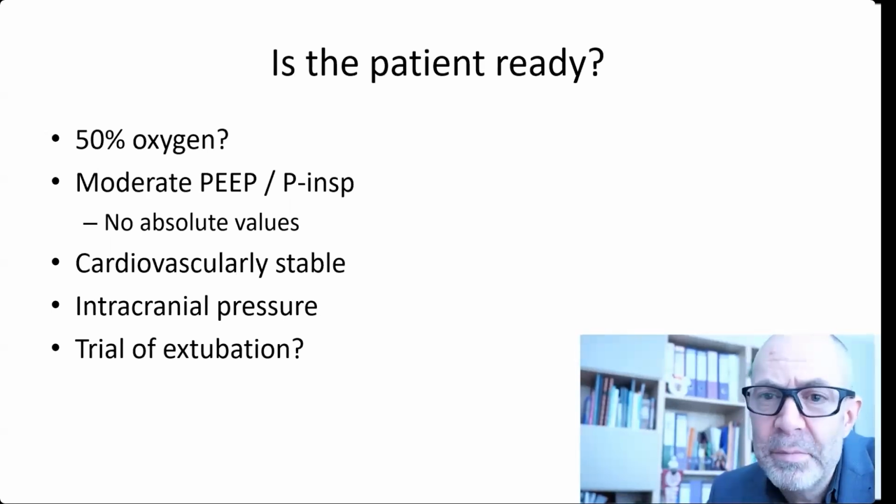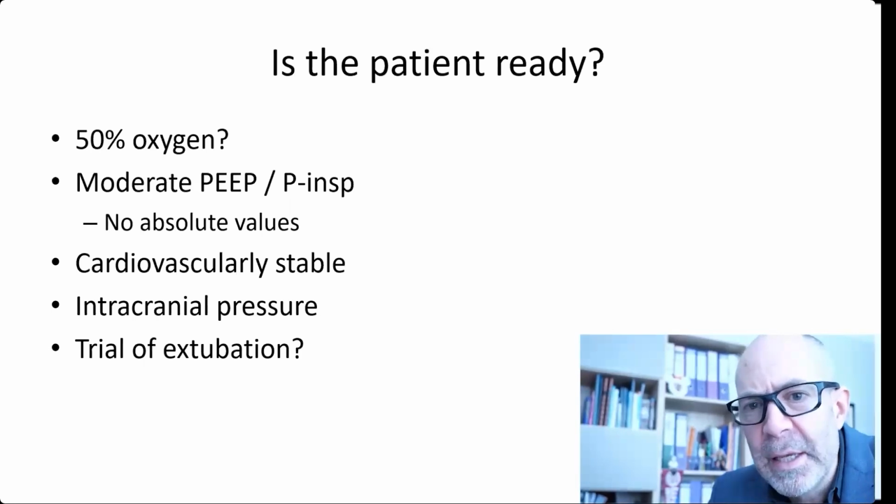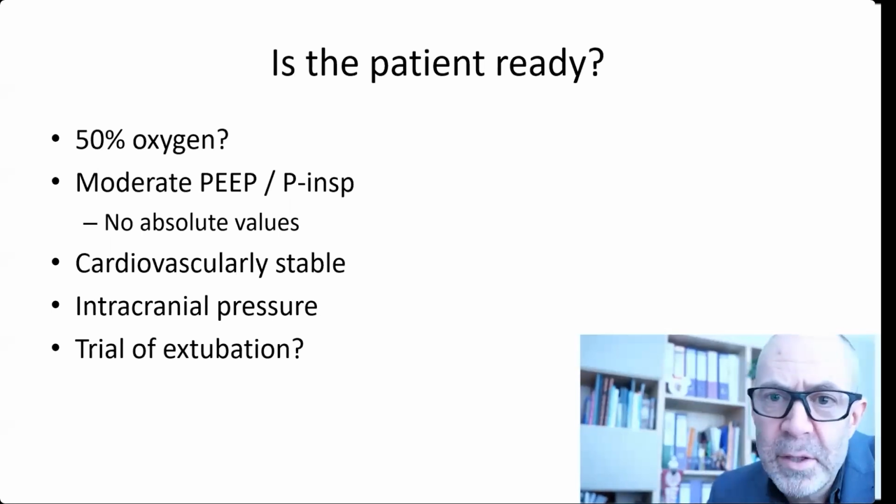And you may want to consider, has the patient had an appropriate trial of extubation? Are we jumping straight into a tracheostomy, or is this something that we've considered? Certainly some of the reviews of tracheostomies that we've performed, particularly in our critical care patients, have suggested that we're perhaps not giving a trial of extubation to some of our patients who end up with a tracheostomy. And I think with the development in respiratory physiotherapy and other techniques we have for keeping patients off ventilators, like non-invasive ventilation, cough assist, things like that, we certainly extubate patients that we probably wouldn't have extubated maybe only 10 years ago. And so I think it's always worth just thinking, is this the right thing to do on this day for this particular patient?